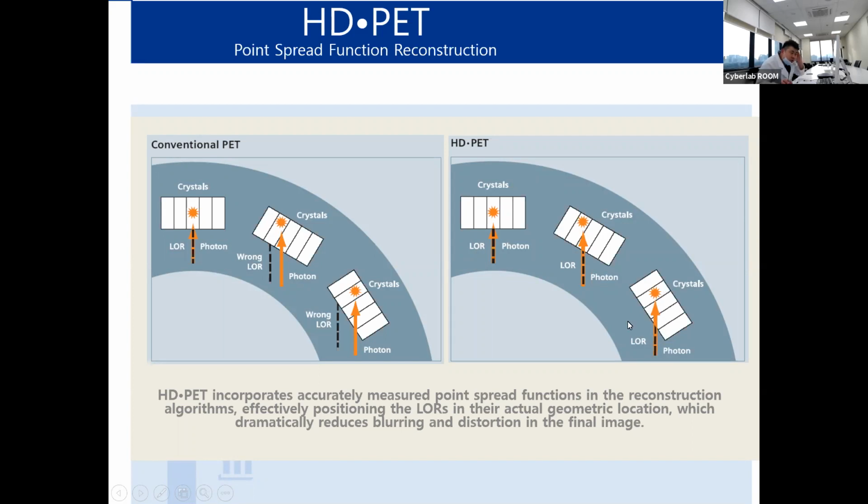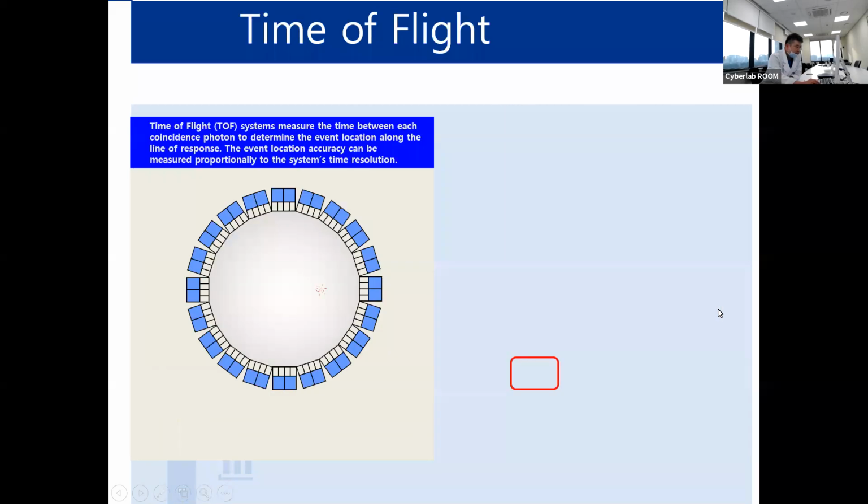So if we apply without PSF, I mean the HD-PET, and if we even apply the HD-PET, image quality is very different. Surely, if we don't apply the PSF HD-PET, images are bad. The quality is bad, but with the PSF the image is very good. Okay, LOR.